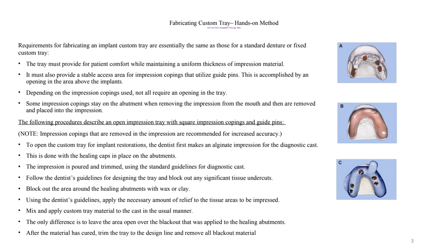Using the dentist's guidelines, apply the necessary amount of release to the tissue area to be impressed. Mix and apply custom tray material to the cast and cure it. The only difference is to leave an open area over the blockout that was applied to the healing abutments. After the material has cured, trim the tray to the design line and remove all the blockout material.